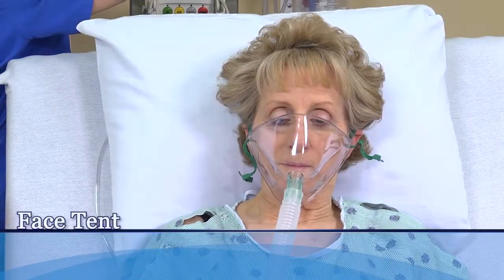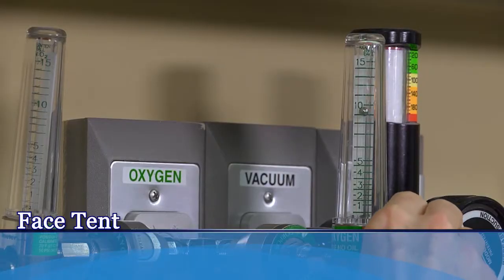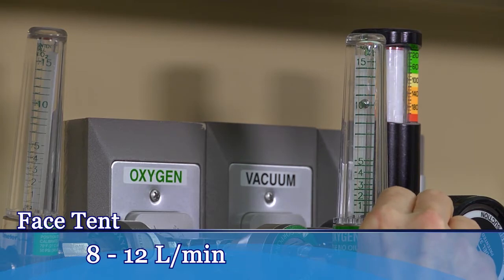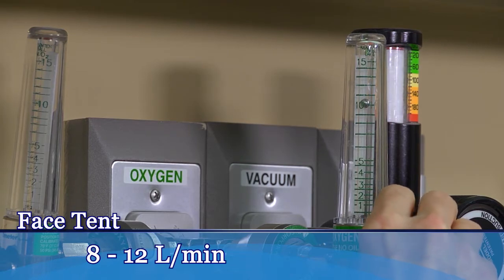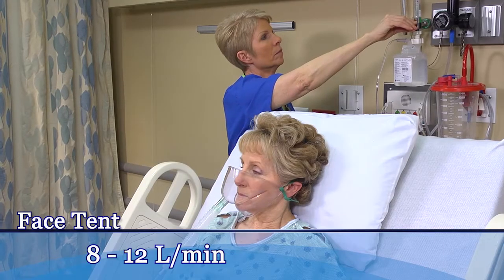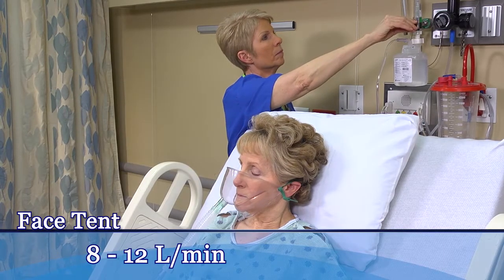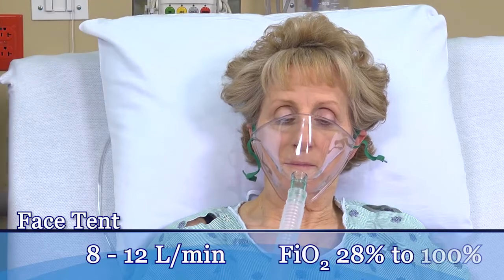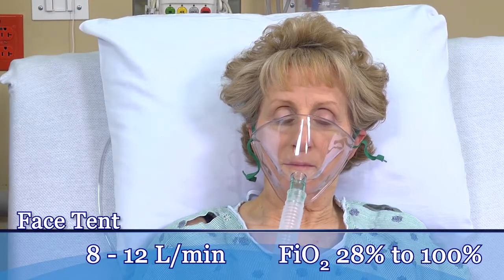If your patient has a face tent, set the flow rate at 8 to 12 liters per minute as prescribed. This rate delivers a highly variable FiO2 ranging from 28 to 100 percent.